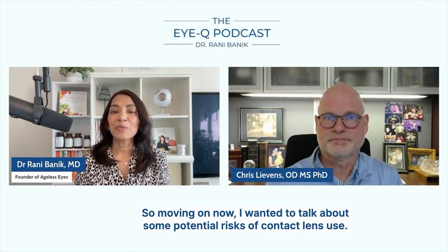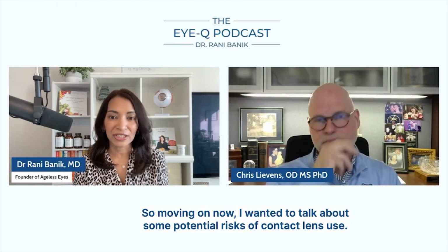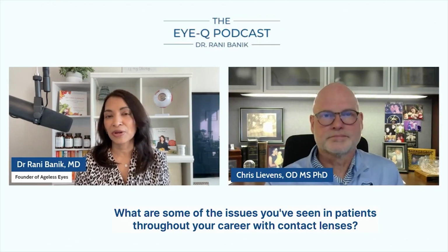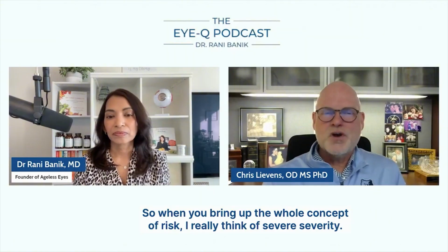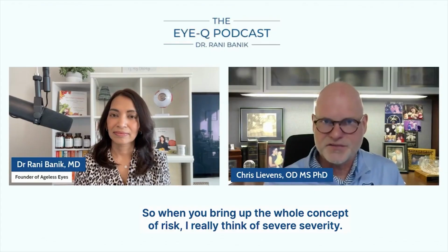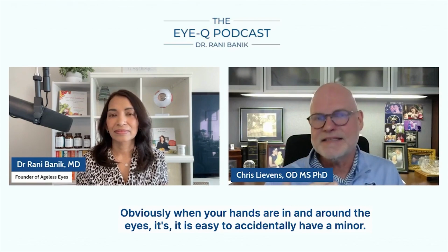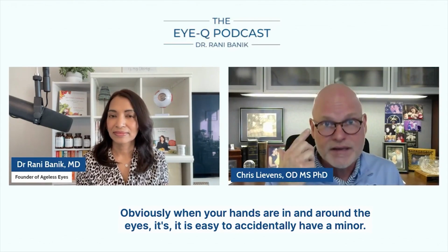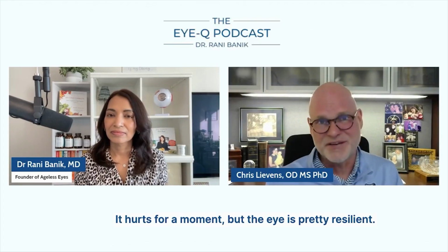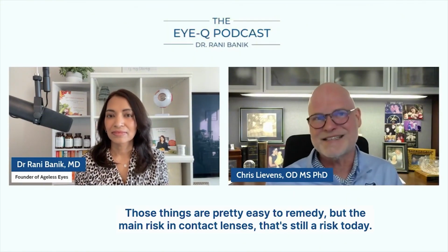Okay, great. So moving on now, I wanted to talk about some potential risks of contact lens use. What are some of the issues you've seen in patients throughout your career with contact lenses? So when you bring up the whole concept of risk, I really think of severity. Obviously, when your hands are in and around the eyes, it's easy to accidentally have a minor abrasion. Maybe your finger touches your eye, it hurts for a moment, but the eye is pretty resilient. It heals pretty rapidly. We talked about allergy already. Those things are pretty easy to remedy.